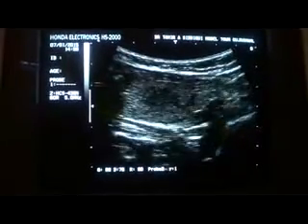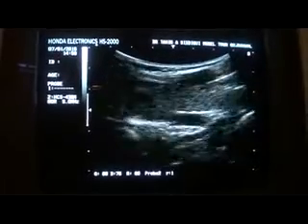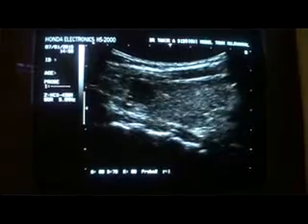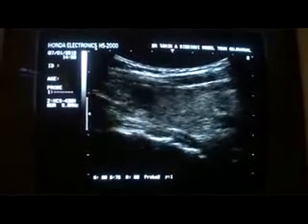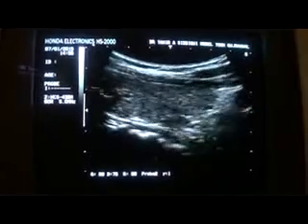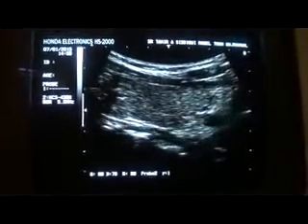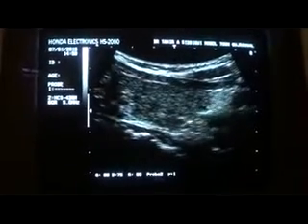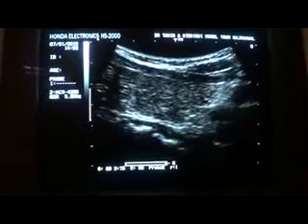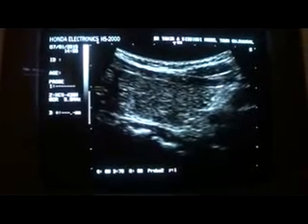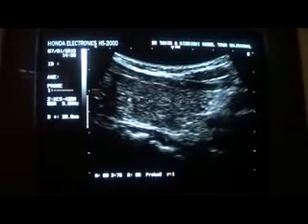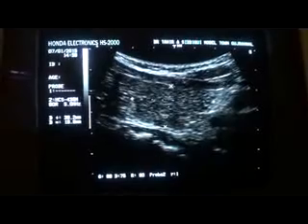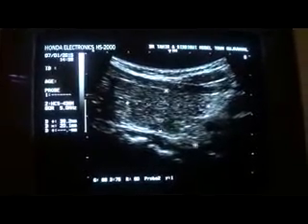There we are. Now here, because I am working with a 5 megahertz curvilinear probe, that becomes a little issue, because the thyroid should be scanned with at least a 7.5 megahertz probe. Now this is the longitudinal section of the left thyroid lobe, which measures 3.8 to 3.9 cm in length, and approximately 2 cm in anterior-posterior diameter.